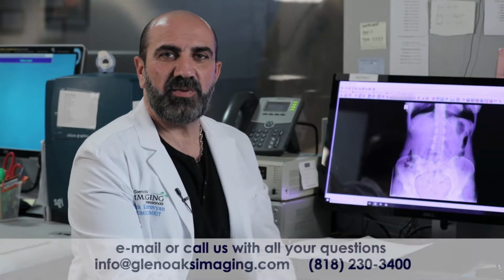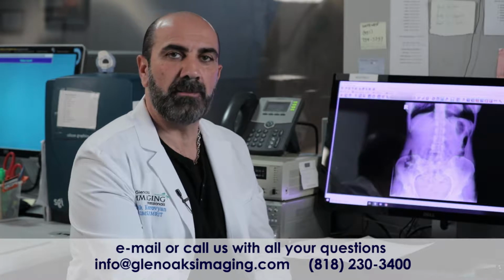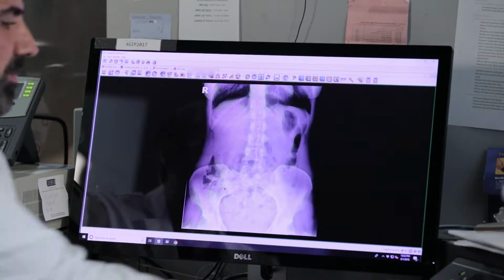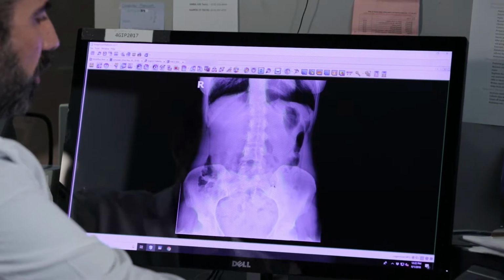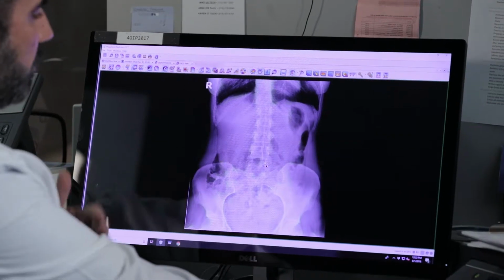As we said previously, we're going to start with an abdomen X-ray, which is also known as KUB: kidney, ureter, and bladder. As you can see in this picture, it can be done either standing up or laying down, and it's either one shot or two shots. Here we see the frontal shot.